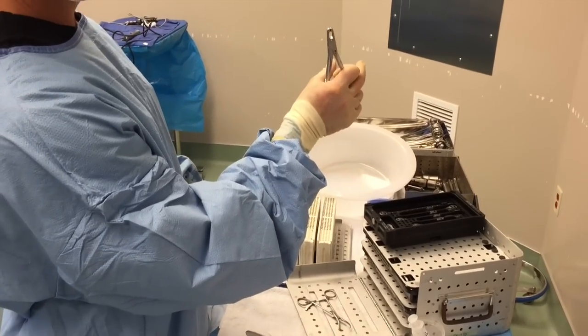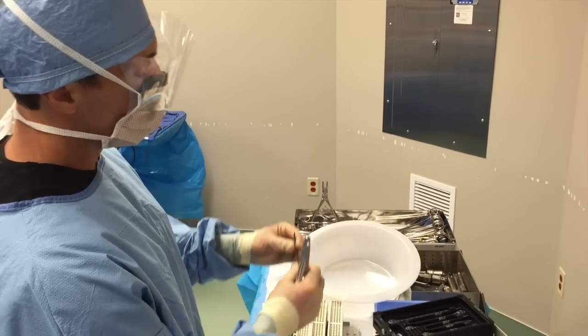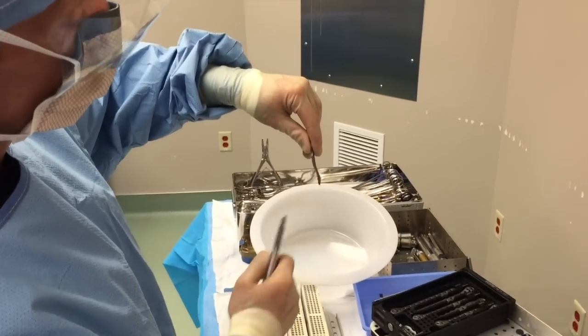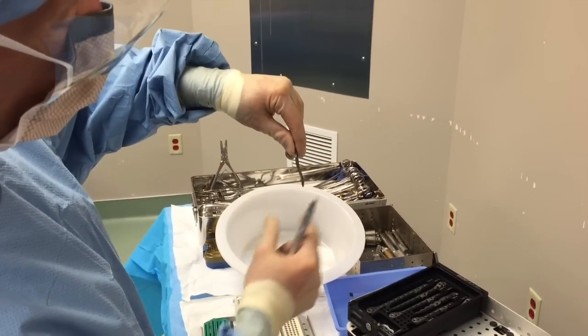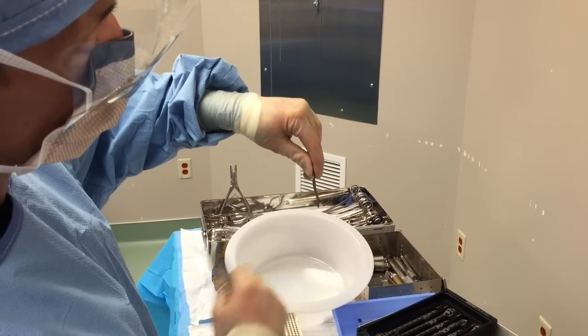This patient — the end of the fibula is kicked out laterally. I'll show you on x-ray later and we're going to try and take her fibula and push it back in with this plate. Even though this is a normal anatomical curve, we're going to bend it forward a little bit to make sure the fibula is kicked back down.